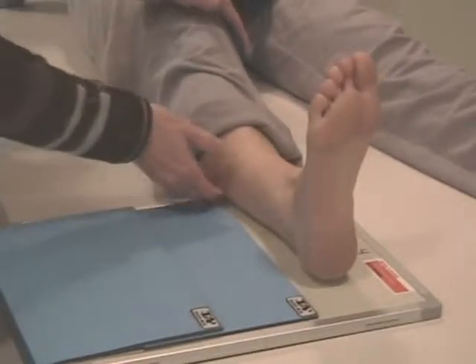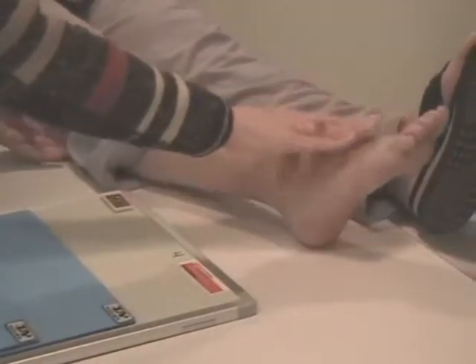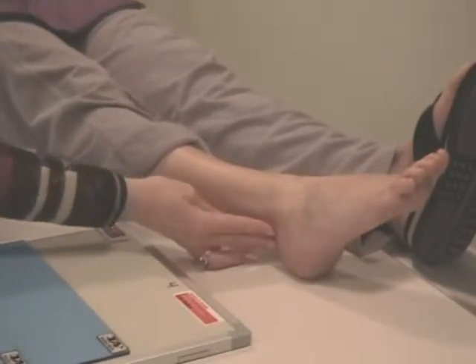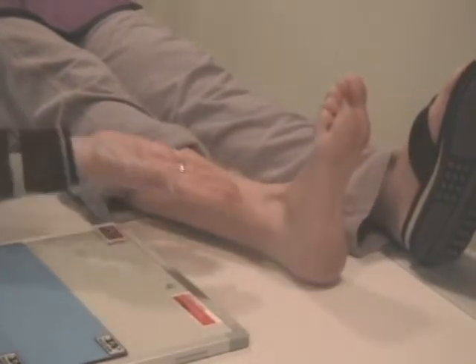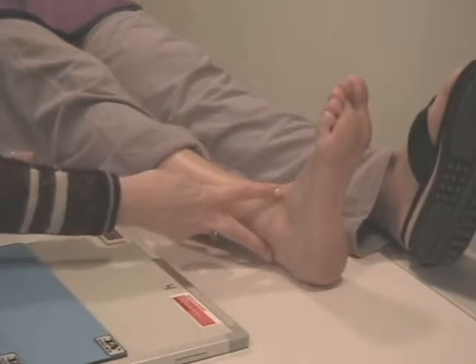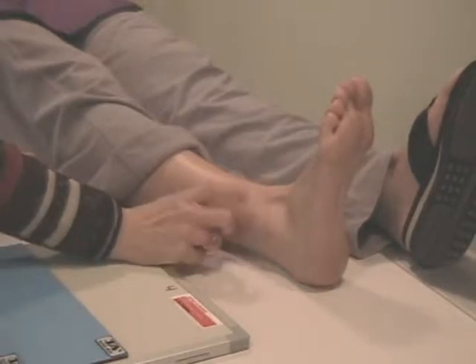What that does, we're just going to kind of angle your leg off a little bit, Jacqueline, here. If the foot is in a relaxed position, the os calcis actually comes in underneath the ankle joint. So we flex the foot and see what happens to the os calcis. It goes that way, so the joint space is more opened. Okay? So attempt to flex the foot, do the best job that you can, but the patient's pain will probably limit you. And we're going to put the leg down straight on the cassette again.